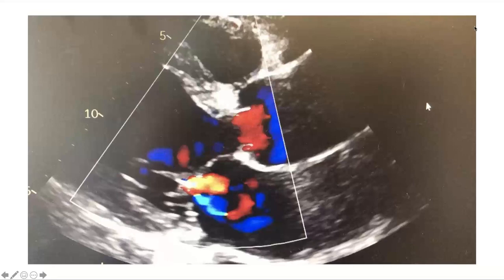Yeah, I think for that, definitely from a pre-surgical planning standpoint, I know that a lot of the surgeons always want to go in knowing what the rest of the aorta looks like.